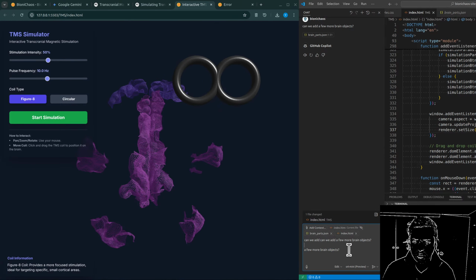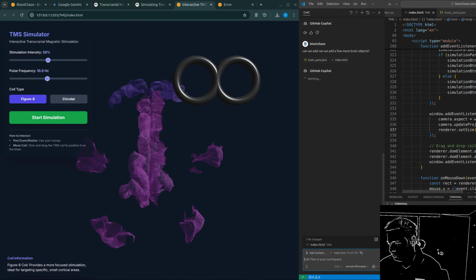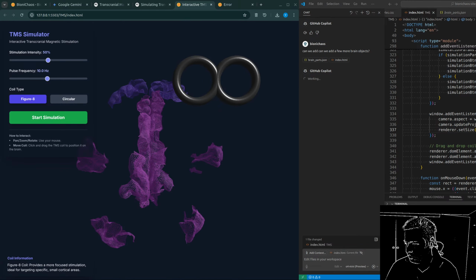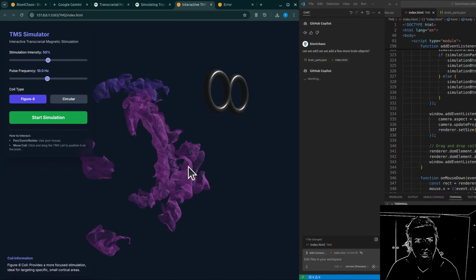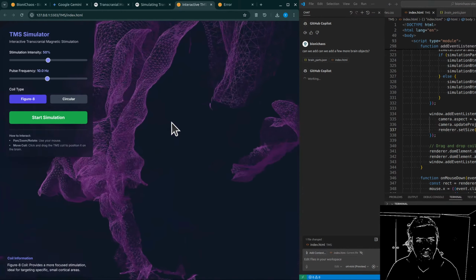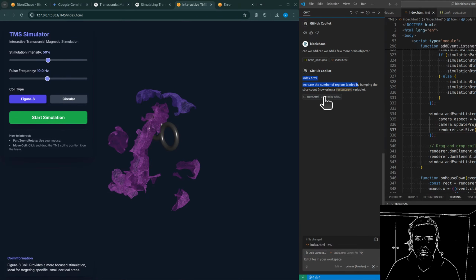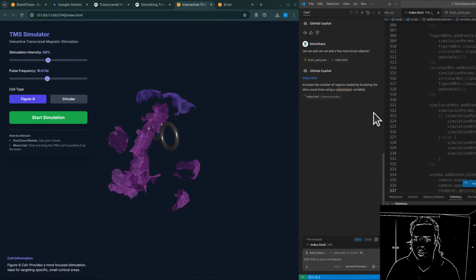One approach is single neuron modeling. Okay. This uses really detailed, biophysically realistic models of individual neurons, sometimes called compartmental models. Compartmental. Yeah, they break the neuron down into different electrical compartments: soma, dendrites, axon. These models simulate how the calculated E field at that neuron's location changes its membrane potential. And whether it's enough to make it fire. Exactly, whether it triggers an action potential. These models often incorporate very detailed neuron shapes, their morphology, and they're often based on principles like cable theory to understand how electrical signals travel along the neuron structure.